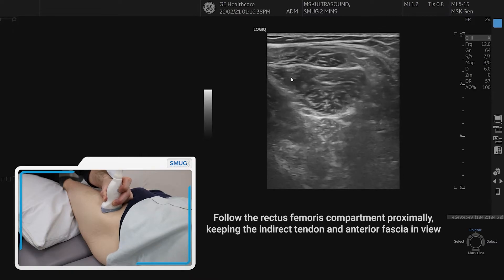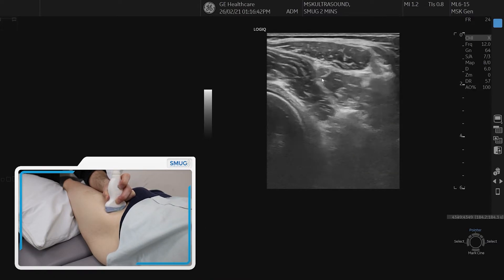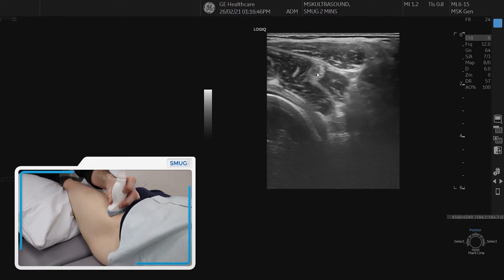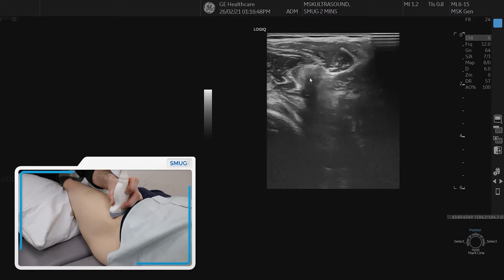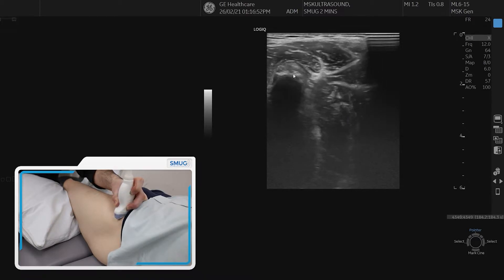If you angle the probe, you can make the tendon disappear. So work your probe a little bit and make that tendon visualize all the time so you know where it sits. Like now it's dark — now I make it nice and bright. Then as we get more proximal, it will start to come into the bone.